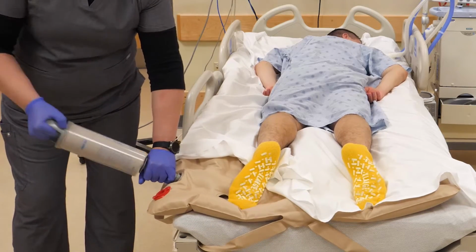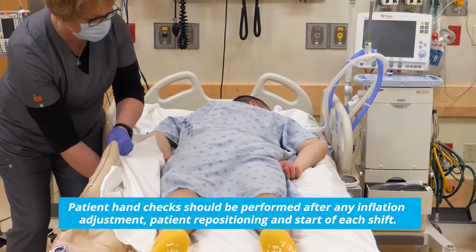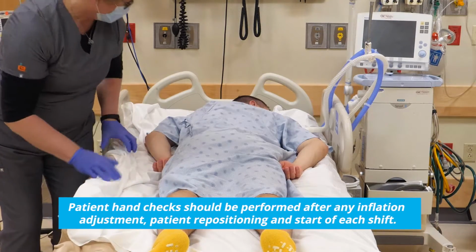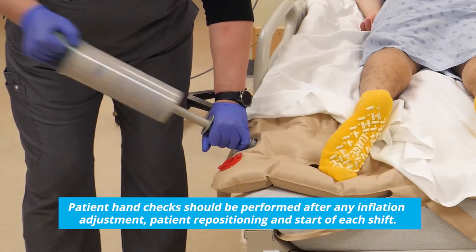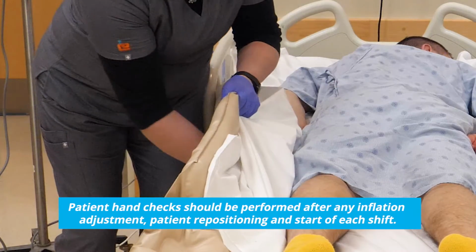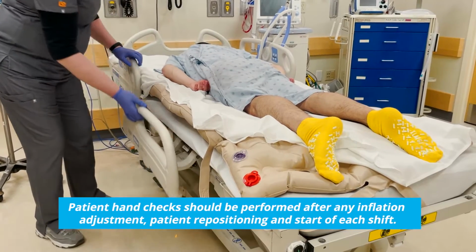Once inflated, it is important to verify the patient is offloaded by performing a hand check. Slide your hand between the overlay and support surface, beneath any area at risk for pressure injury, such as the lower rib cage or the pelvis. Your hand should slide easily underneath the patient. If it is difficult to slide your hand under the patient, additional strokes of air are needed. If you cannot feel the area at risk for a pressure injury, tap on the clear valve to release some air. Return the bed rails to the proper position.